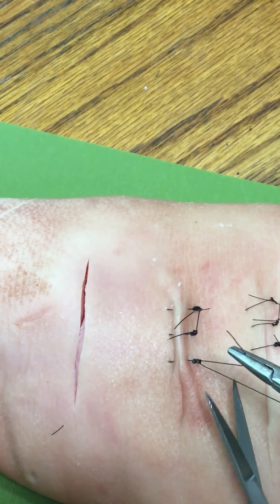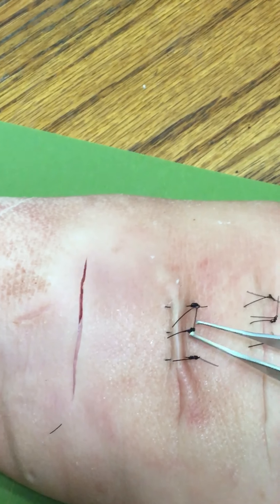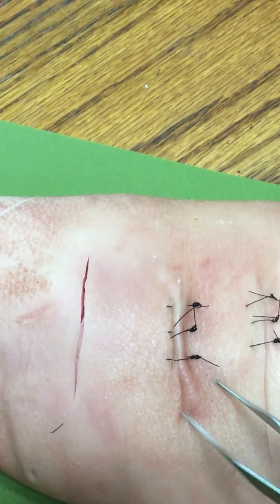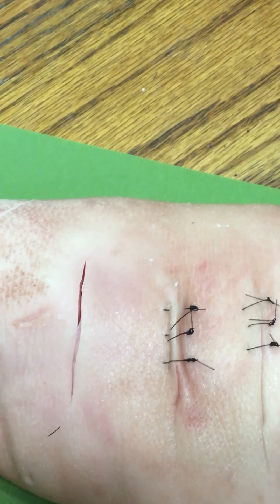You can see as the suture gets bigger, the knots have an easier time slipping. These knots look a little bit loose, but they're coming down as square knots because I'm alternating my throws. However, because the suture is larger, you might need to put a few more throws in there, because prolene and nylon tend to slip.